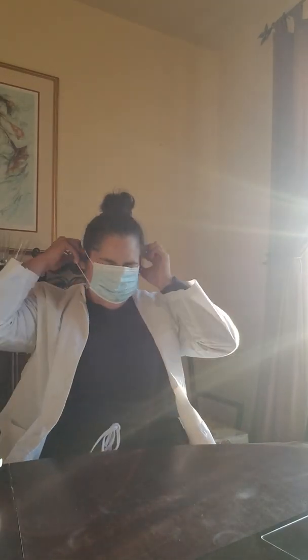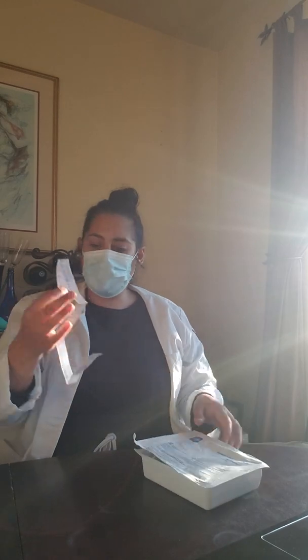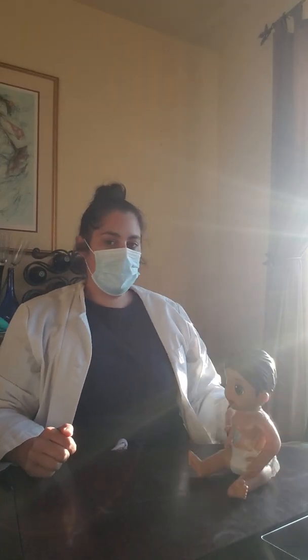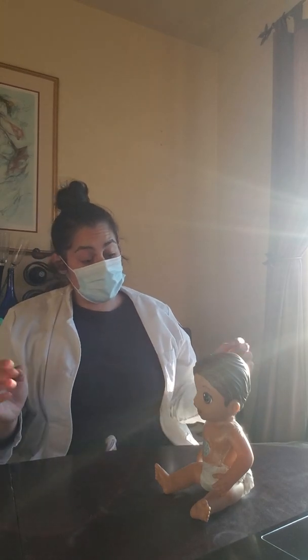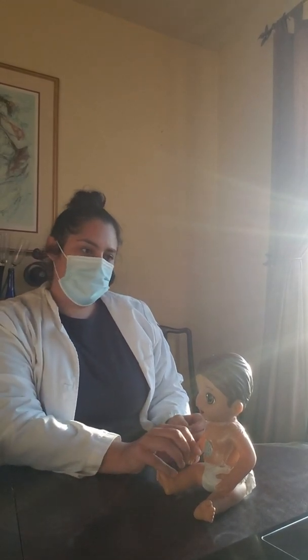And because of COVID, we are going to be wearing our mask, of course, to start with. And I have my kit and my measuring tape. And I think I'm ready to go inside. So, hi, my name is Danielle Sapiens, and I'll be your student nurse for the day. Provide privacy. Do you mind telling me your name and date of birth, please?